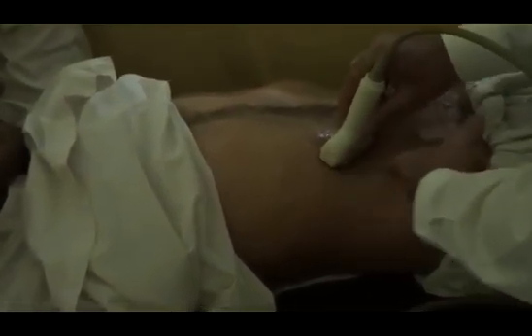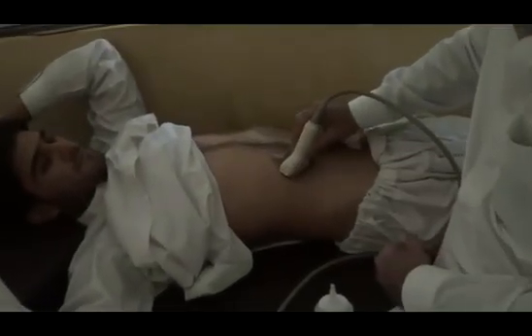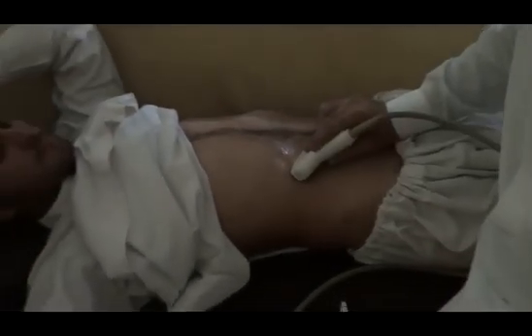This is scanning plan number 2. Place the probe below the costal margin — this is the almost mid region of the subcostal area. I have placed the probe below the costal margin at about 60-degree angle with the marker pointing towards the patient's right shoulder.